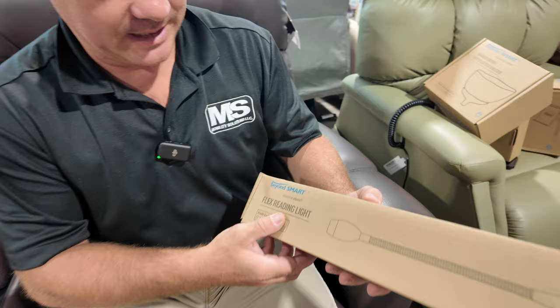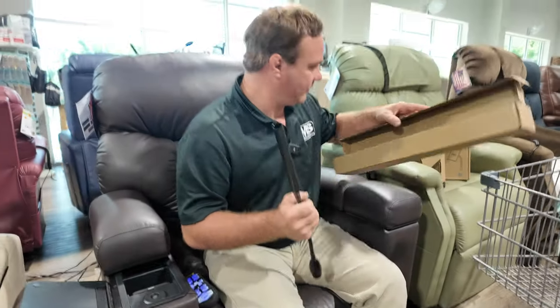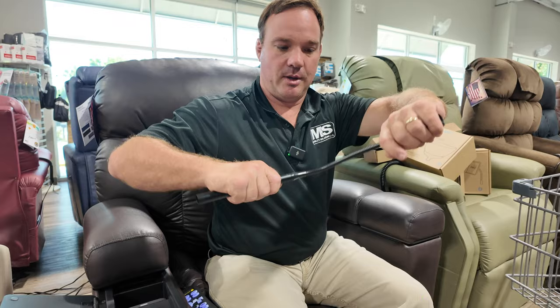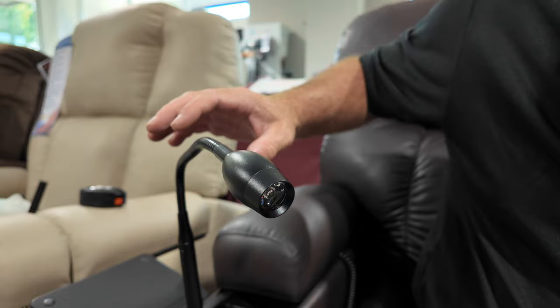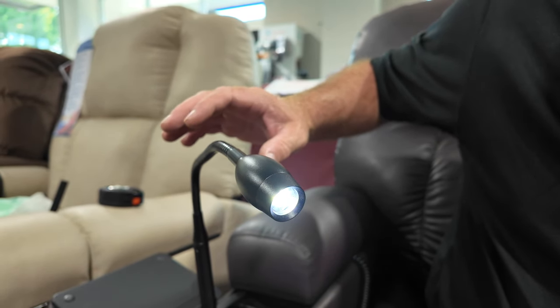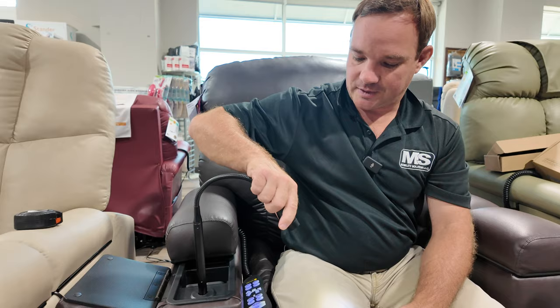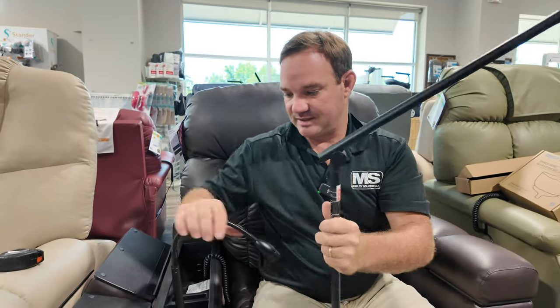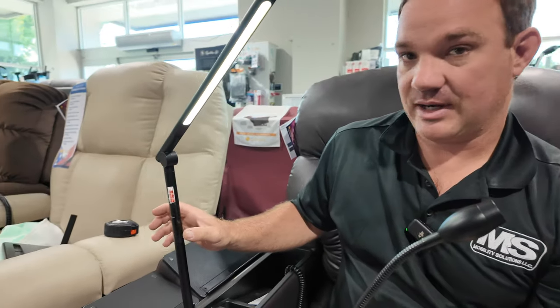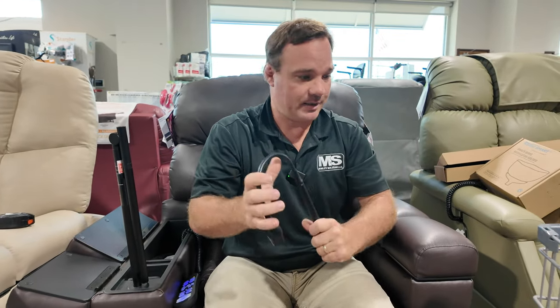Next is the flex reading light. The chair does come with a light already, just not a flexible one. If you're reading at night and want more control, the flex light gives you more flexibility. You plug it right in — it's touch-activated with different brightness levels. Comparing the two: the stock light is not flexible, but the flex version is. It also goes right into the dock.